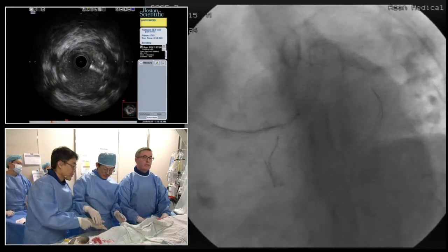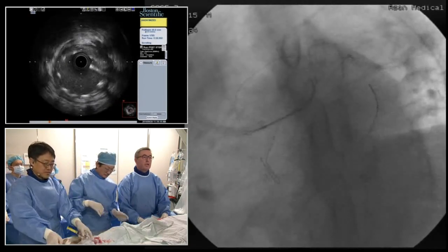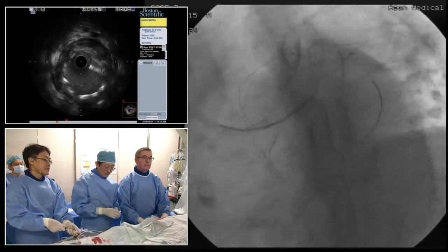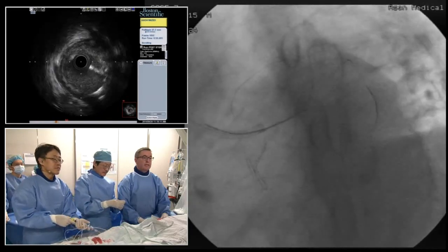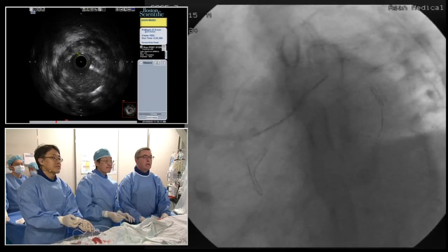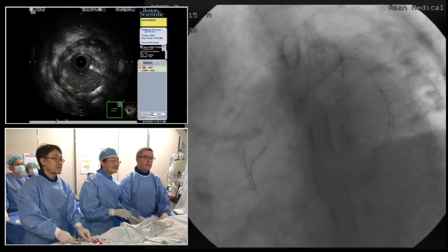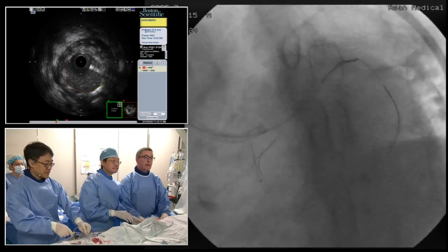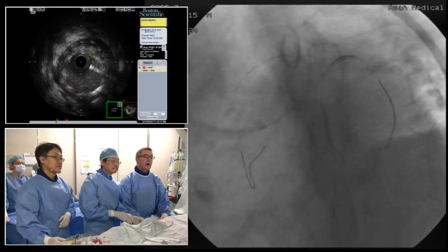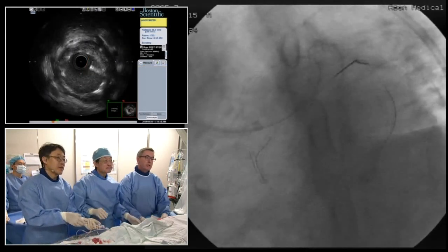I mean, the only argument for doing the pot first is that if you're not undermined, you obviously can get the wire underneath the strut. Yeah. So some people would do the pot at this point, before we rewire the branch. Look, if there were any problems getting down there, I would completely agree. But this is pretty straightforward.